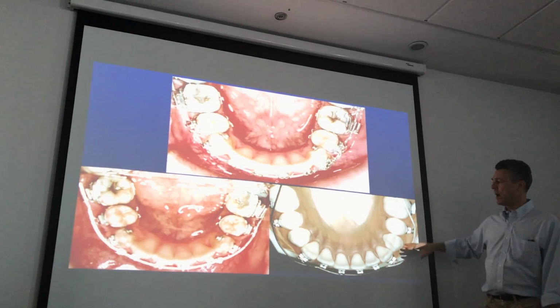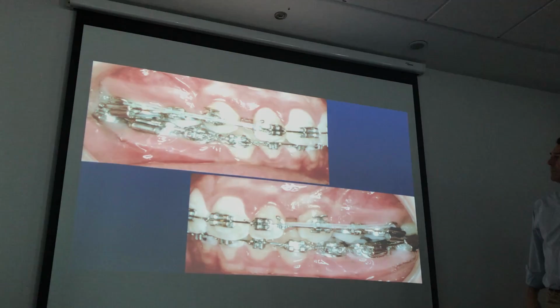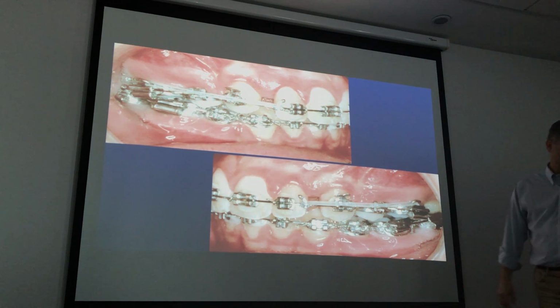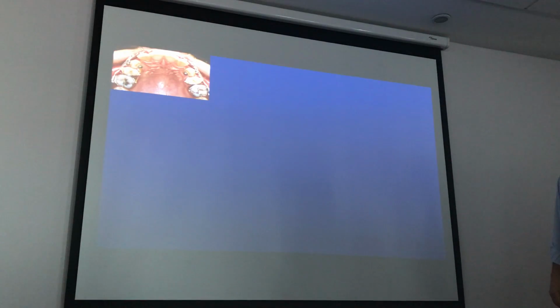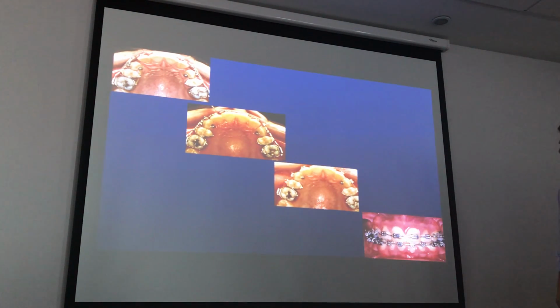A little bit for outside. Close the lower arch. And now we are closing the incisors. The midline is centered.